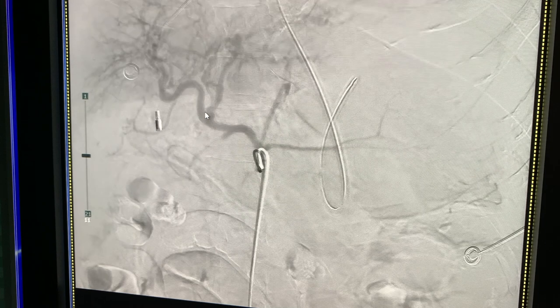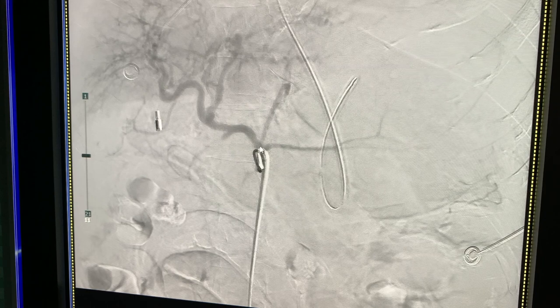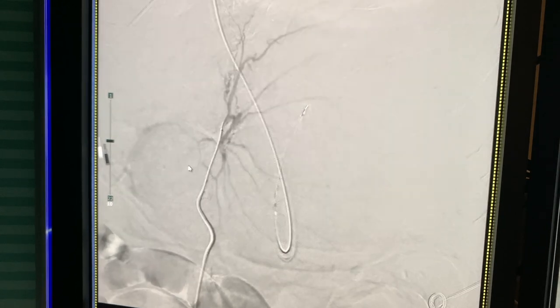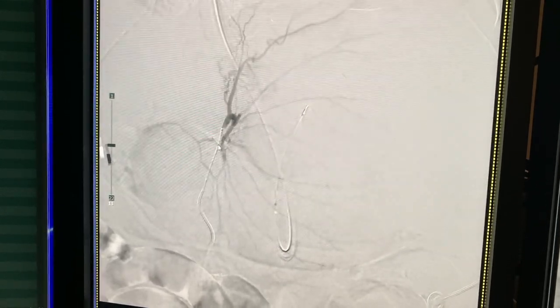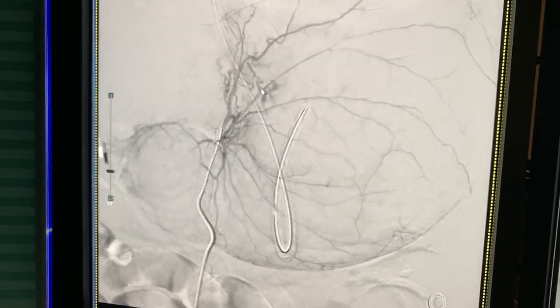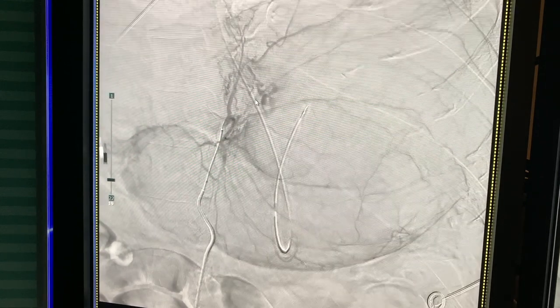After the CTA, we brought him into the IR suite and started with a celiac artery run. You can see conventional celiac anatomy with the splenic artery coursing to the left, the left gastric artery coursing cranially, and the common hepatic artery coursing towards the liver to the right. On a super-selective angiogram with the microcatheter in the left gastric artery, you can see an area of extravasation near the cardia of the stomach, which correlates with what we saw on CTA — consistent with arterial hemorrhage.